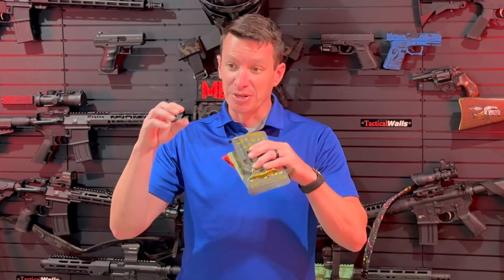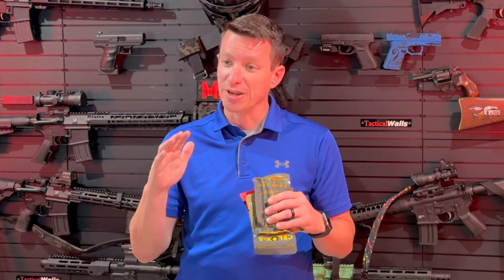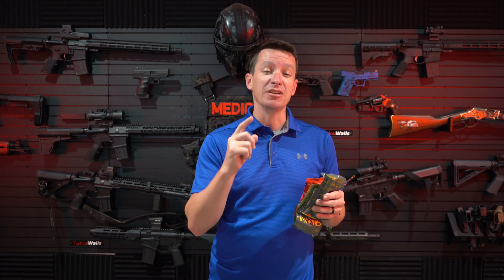So this new product is called Trauma Gel. It's a syringe that's supposed to be a gel that comes out to control major bleeding. Sounds promising, but we'll see. But we know that there are several hemostatic agents on the market already.